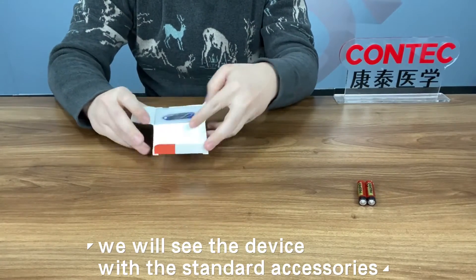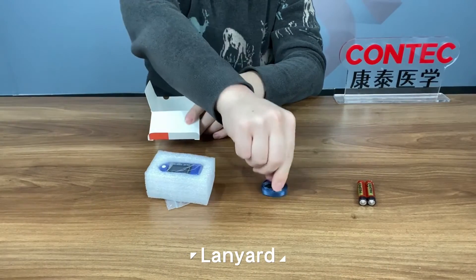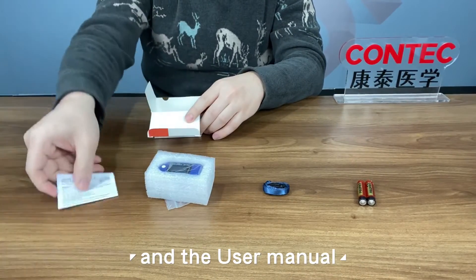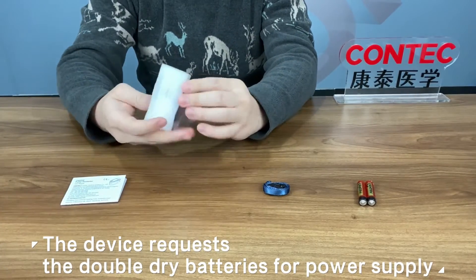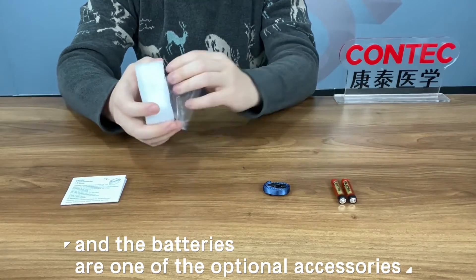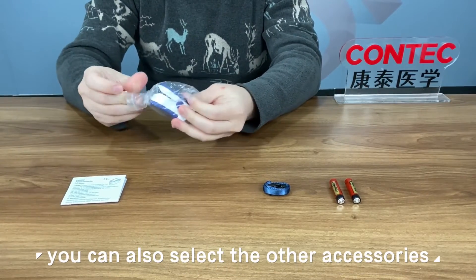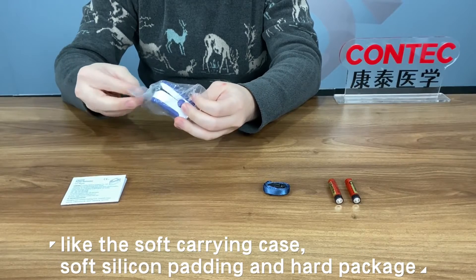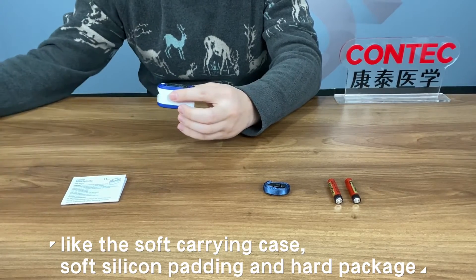Open the box and we will see the device with the standard accessories: lanyard and the user manual. The device requires double dry batteries for power supply, and batteries are one of the optional accessories. You can also select other accessories like the soft carrying case, soft silicon padding, and hard package.